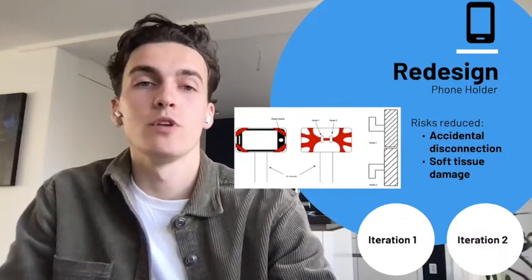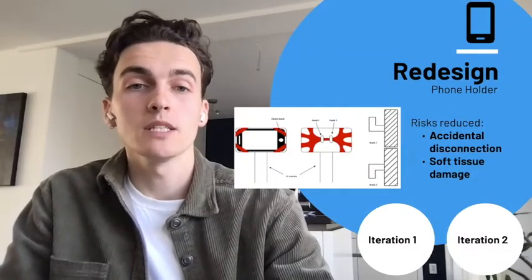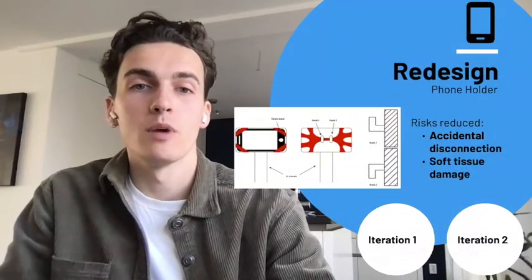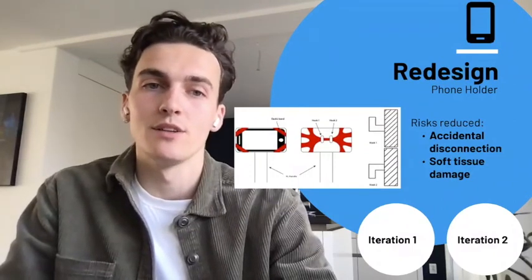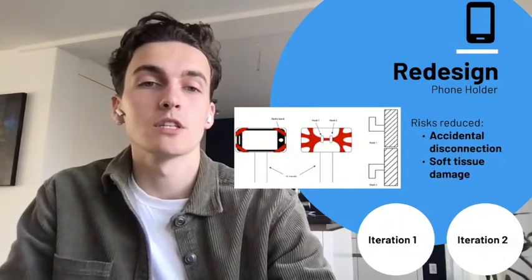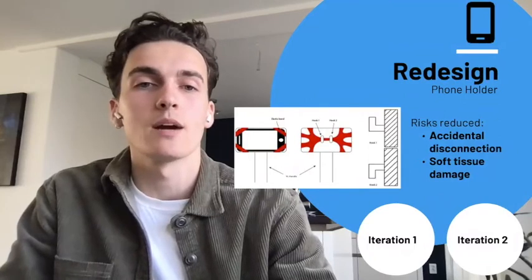Furthermore, this can also lead to faster deterioration in function of the cable. To minimize the risk, a phone holder will be added to the design. This adjustment will also make sure that the phone and mouth will be better aligned, which allows the anesthesiologist to better divide his or her visual attention between the phone and the mouth. This can subsequently decrease the risk of soft tissue damage caused by the absence of either indirect or direct visual feedback.